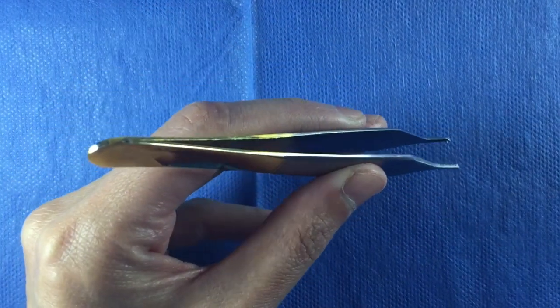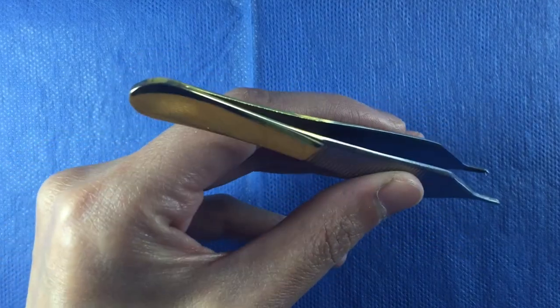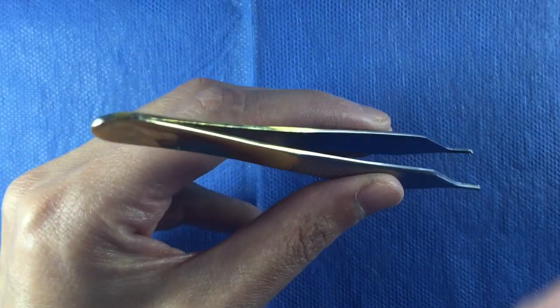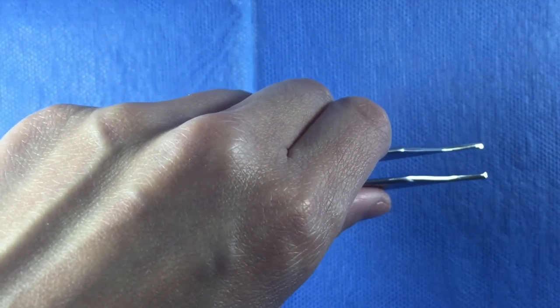With your non-dominant hand, pick up a forcep as you would a pen. Do not use an overhand approach like you would a dinner fork. That is poor form.